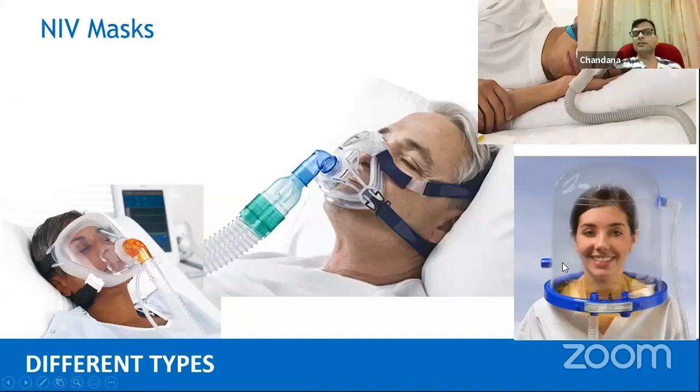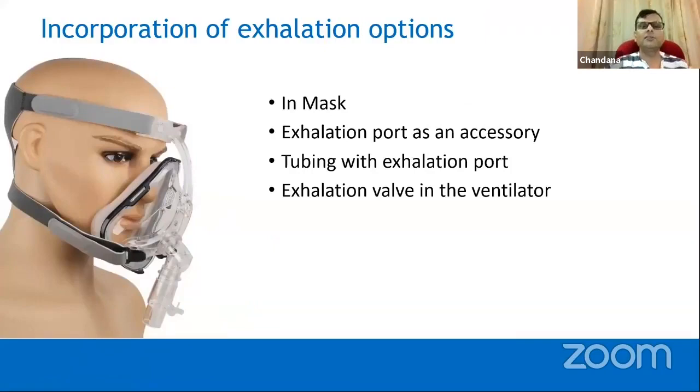So this is the device Italian people used, the helmet device, which I don't think is widely available in our country. But this is the mask, the full face mask. We still call it the full face mask or the NIV face mask. This is a commonly available device. So we'll try to see what these devices are, because nowadays we are getting so many kinds of devices.